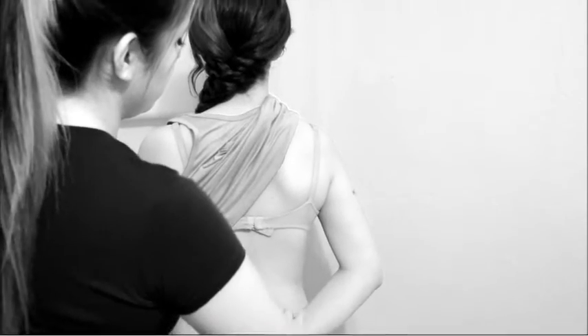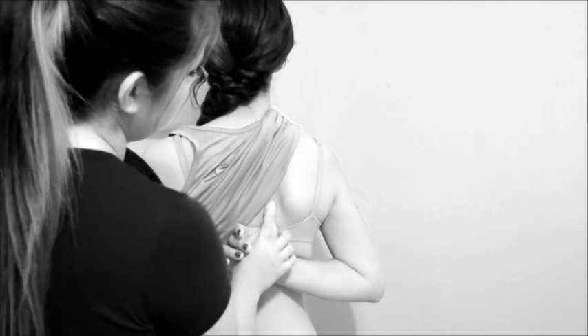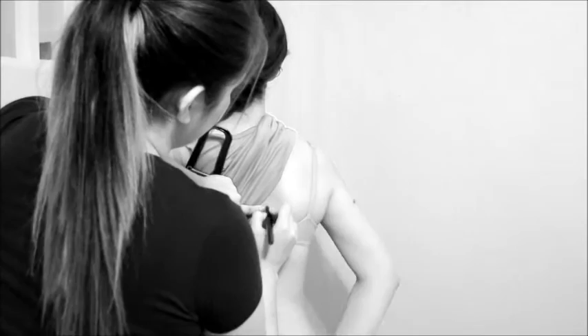Subscapular: diagonal fold at a 45-degree angle, 1-2 cm below the inferior angle of the scapula.